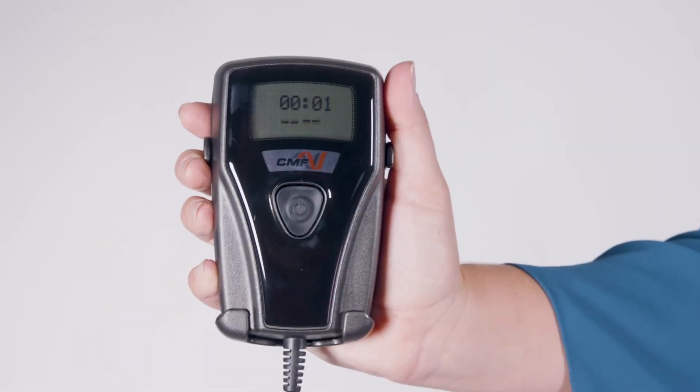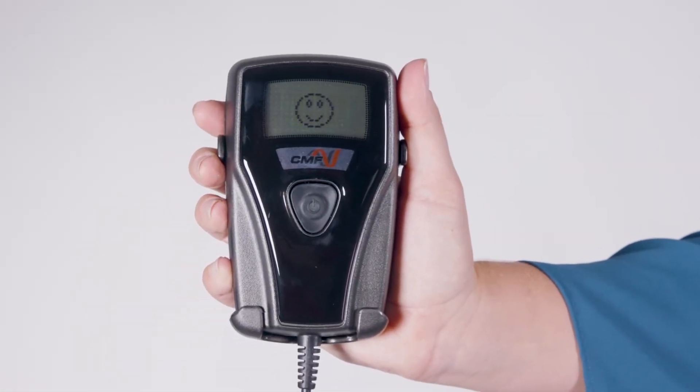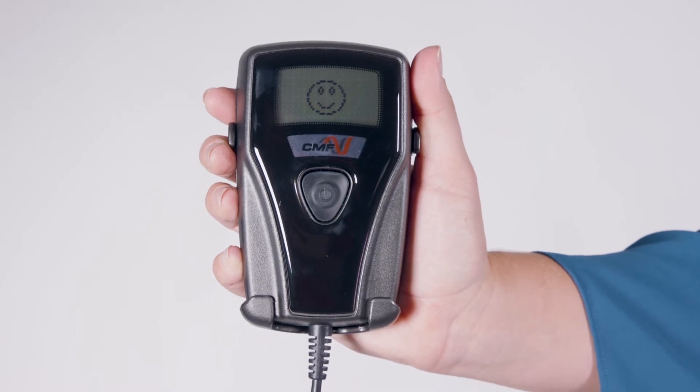After 30 minutes, the treatment complete icon will appear as a smile face on the display. The device will beep twice and automatically shut off.